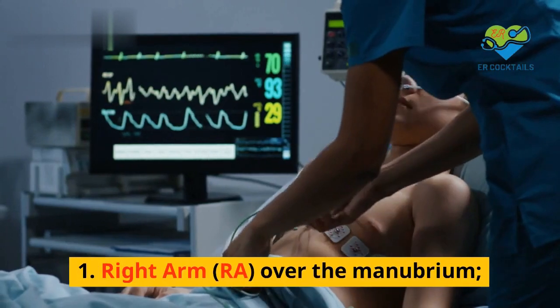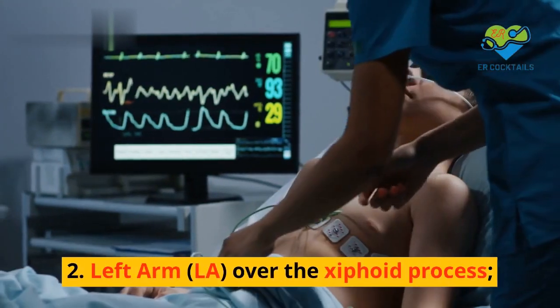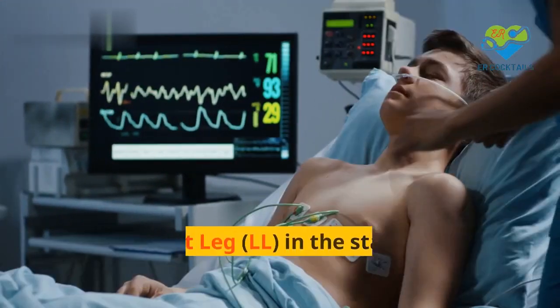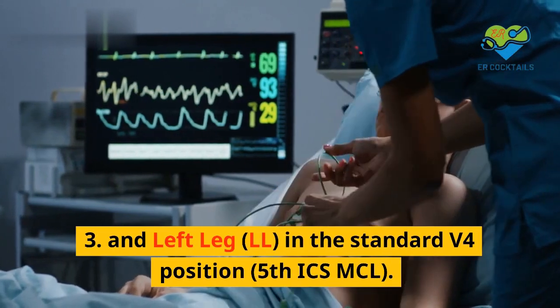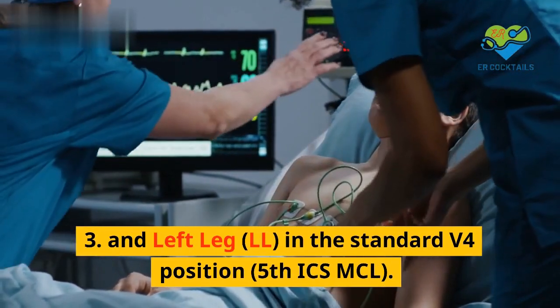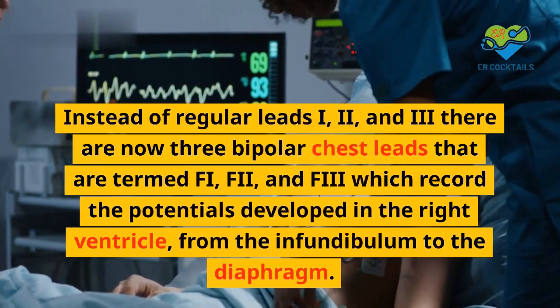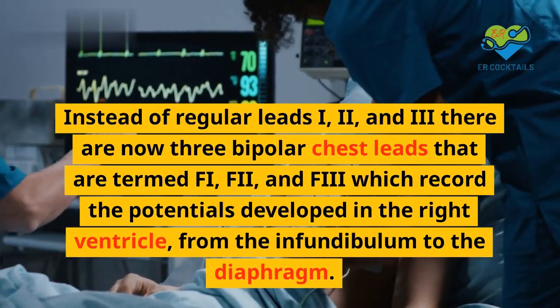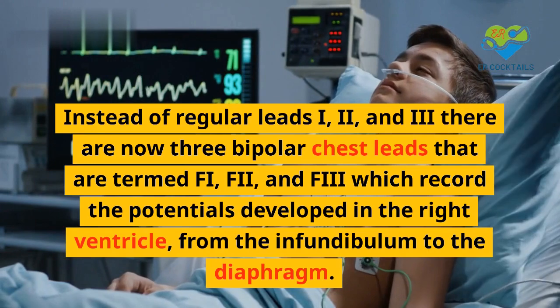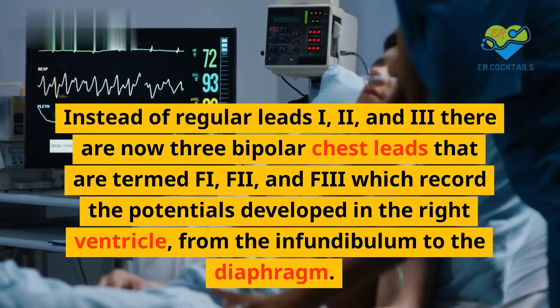1. Right arm, RA, over the manubrium. 2. Left arm, LA, over the xiphoid process. 3. And left leg, LL, in the standard V4 position, 5th ICS MCL. Instead of regular leads I, II and III, there are now 3 bipolar chest leads termed FI, FII and FIII, which record the potentials developed in the right ventricle, from the infundibulum to the diaphragm.